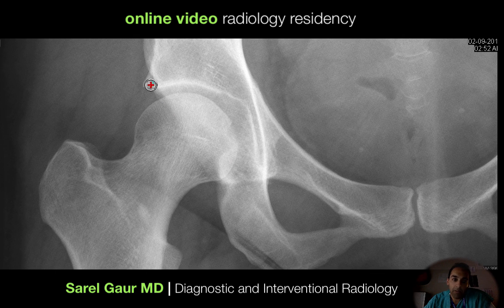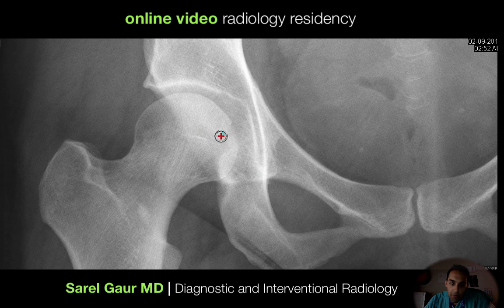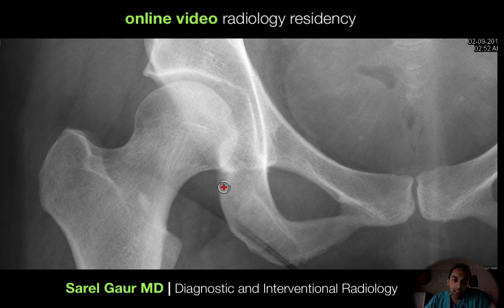I also want to point out the acetabulum here. You can see two lines, which represent the anterior and posterior wall. The anterior acetabulum is continuous with the superior pubic ramus — I can track that back and see a faint line representing the anterior wall of the acetabulum. The posterior wall is the line continuous with the ischium. In a typical hip dislocation, the femoral head dislocates posteriorly and cracks the posterior wall, so I'm looking for traumatic injury there.